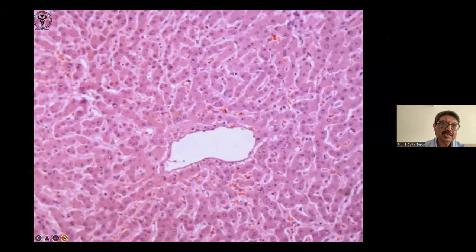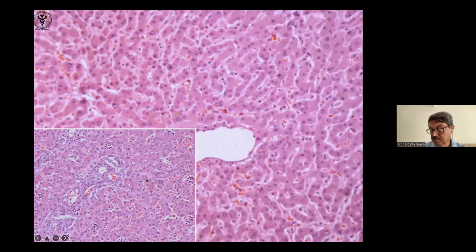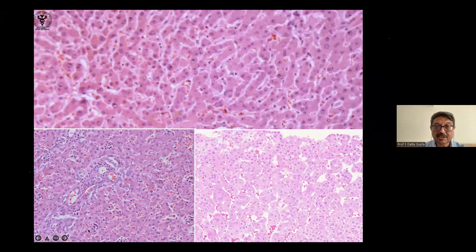In an adult, the liver cells are one cell thick. You see this here? Their cords are one cell thick, and sometimes you can see the canaliculi here. When it is regenerating, or in children below 4 or 5 years, they are two cells thick. When they are two cells thick, it means it is regenerating or that you can get in cirrhosis. If it is three or more cells thick, then it is abnormal. You get that in malignancy or hepatocellular carcinoma. This is very important. So the thicker the cell plate, the more the likelihood that it is malignant.